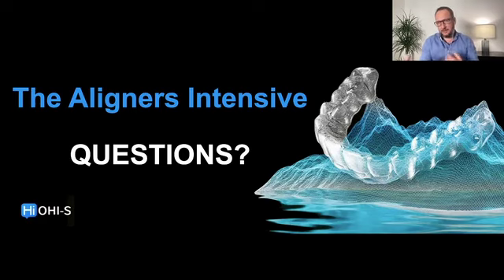Then I am using the collaboration with DSD, and in the Nemotec software, I can overlap the STL file with the photo in the full smile, so I can have in the model the natural head position, and then transfer this to Invisalign, okay?